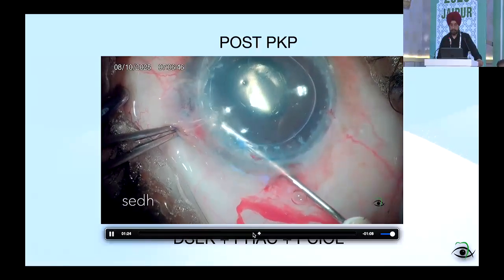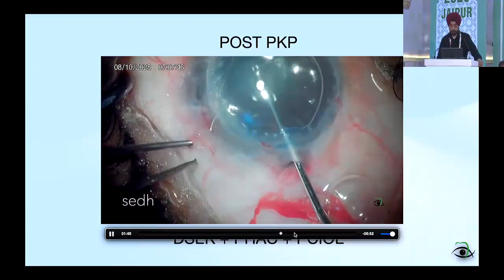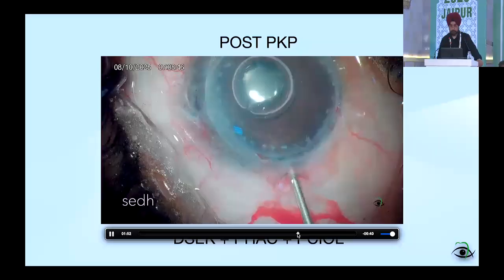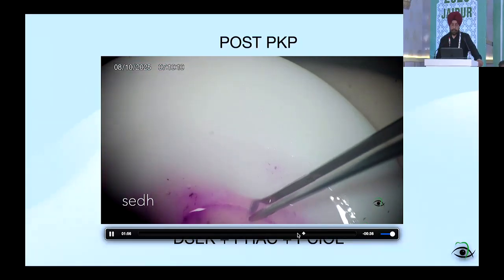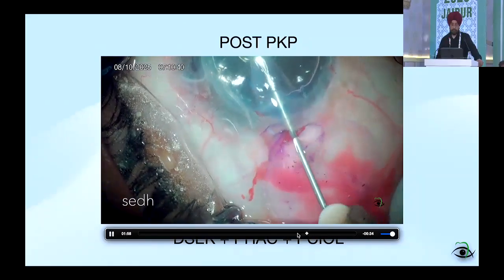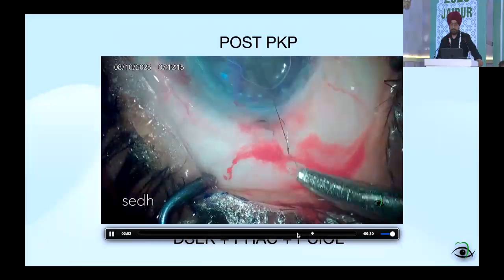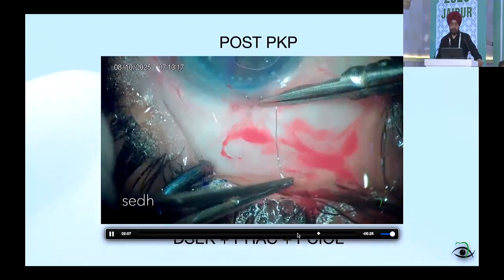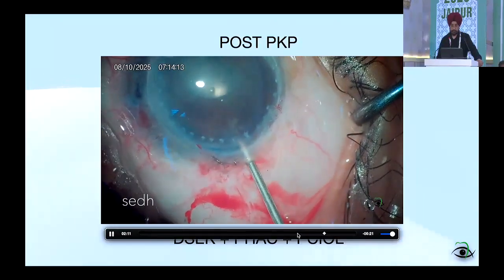Scoring the descemet. So it's better to mark the trephine line when you cut the tissue so that you have well stained margins that would make the graft clearly defined in the anterior chamber and to make it settle the way you want.